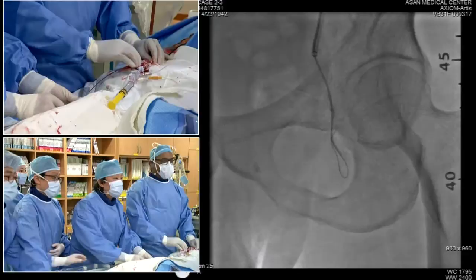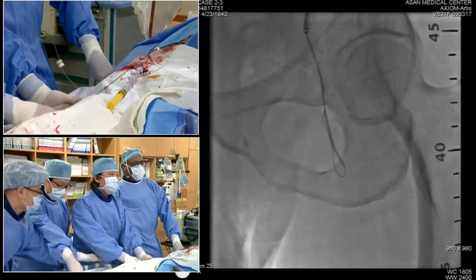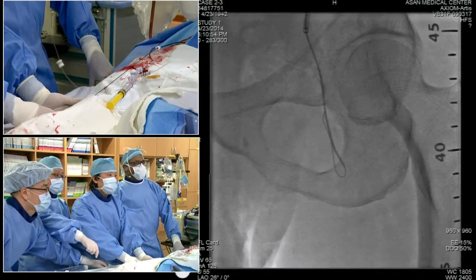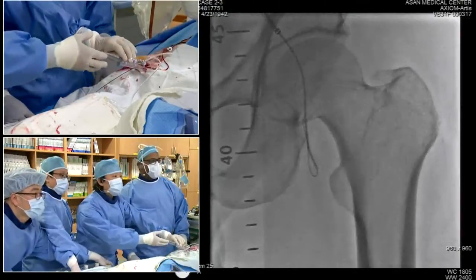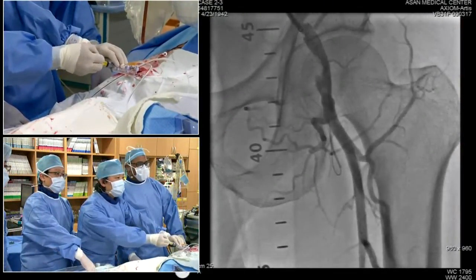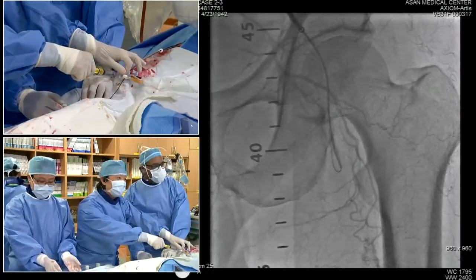Let's stop there. Okay, let's go work in the straight AP now. This is not something that, obviously, when we start moving here and coming subintimal. If we can take a quick picture here, just a quick shot of floor. Give me an injection. Okay. So we are clearly in the subintimal space here.